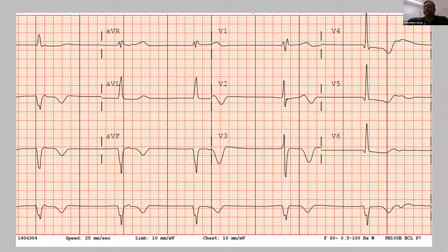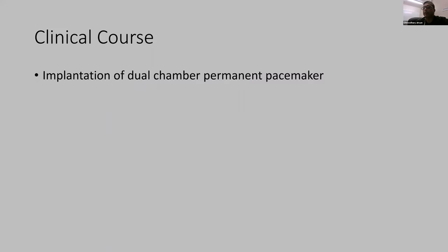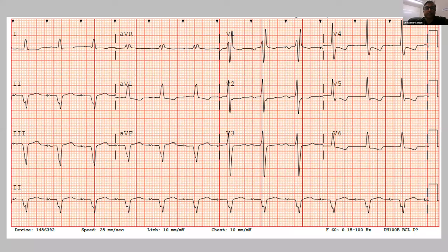And the patient is not having any chest pain, is dizzy. So, I said that let's figure out the electrical side. We did the echocardiogram. Echo EF was preserved before, EF normal now, and we put a permanent pacemaker. Question now, after putting the permanent dual chamber pacemaker, this is A paced, and then you see QRS.